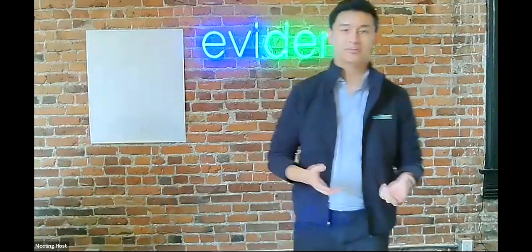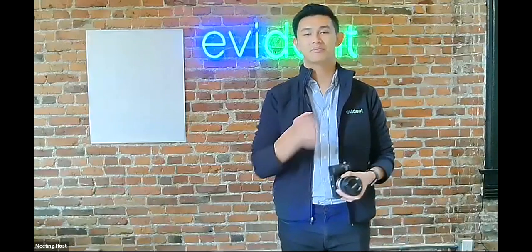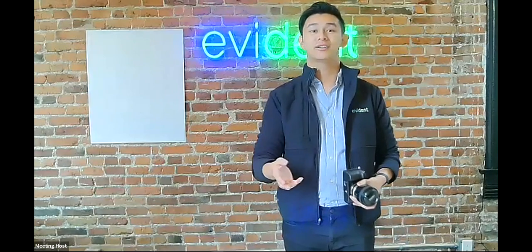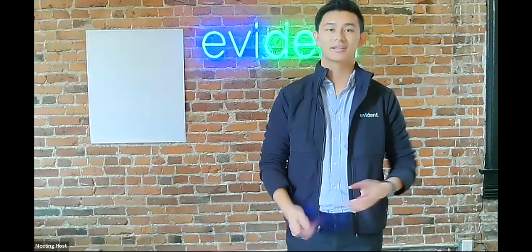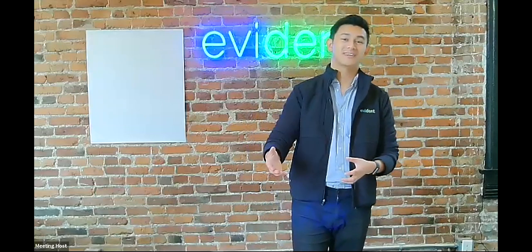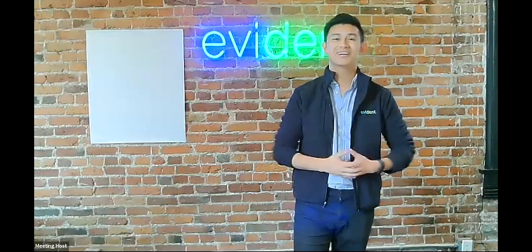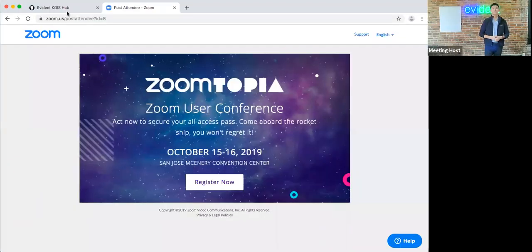So now that you all have all your photos, depending on the equipment you have, you can transfer the photos onto your computer. So for example, if you have a professional camera like a DSLR or a mirrorless, just take out your SD card, plug it into your computer, and then drag it onto your desktop. If you have a smartphone, you can email the photos to yourself onto your computer, and then again, drag onto your desktop. So the next step is getting the photos onto the hub, and I'm going to pass the torch to Chloe, and she's going to be teaching you how to upload the photos onto the hub.